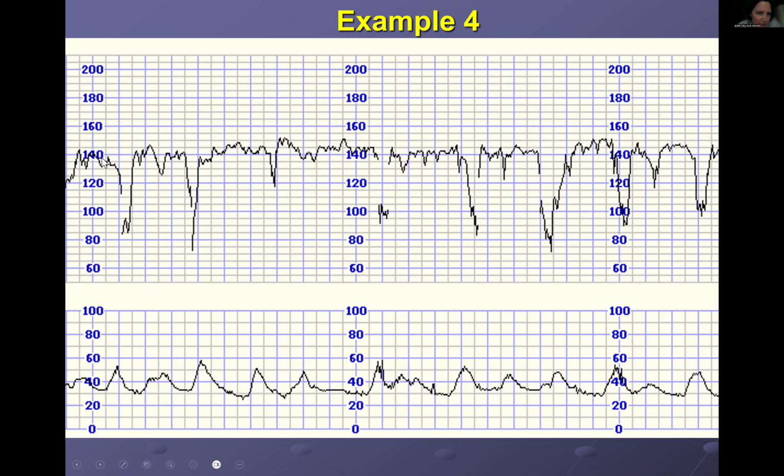So this is a variable because they're shouldering, but with a late component. And this one might have a bit of an early component. This one here is late. It doesn't correspond with any contraction.